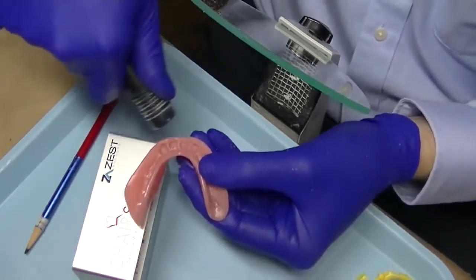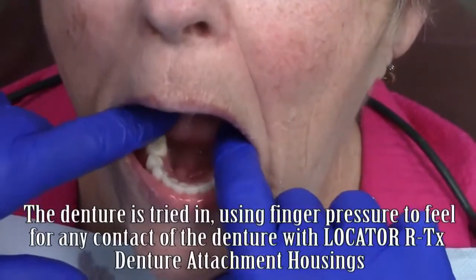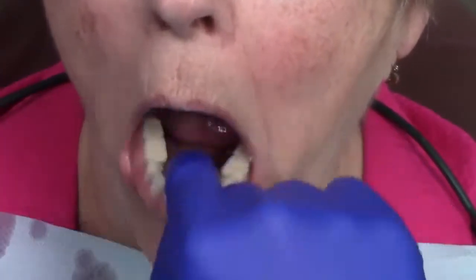prepare the recess perfectly. The denture is tried back in the mouth, ensuring that finger pressure is used to feel if there's any contact of the denture to the housings.